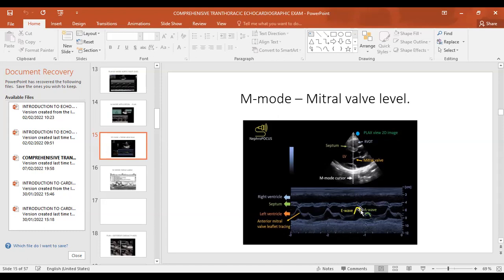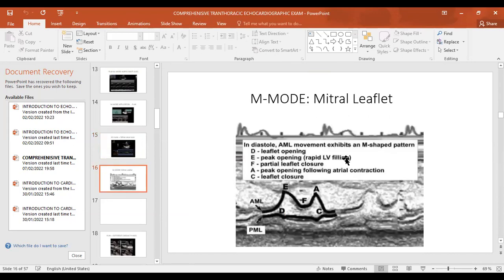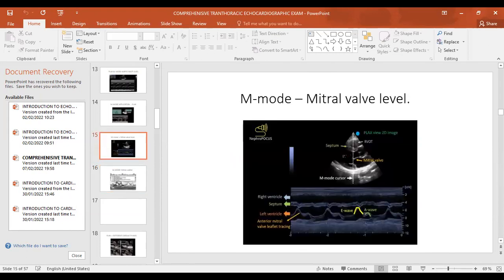But you measure that EPSS. So the normal mitral valve must open and touch the septum. What does it mean? It simply means the LV is filling properly. That is very important. And then you also have to understand that when the EPSS is big, what makes it big? Now in diastole, we said it has to touch there.